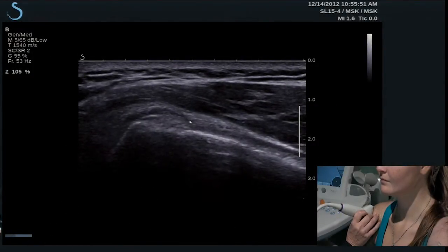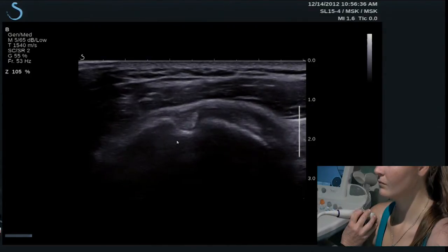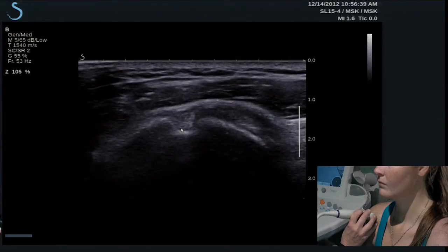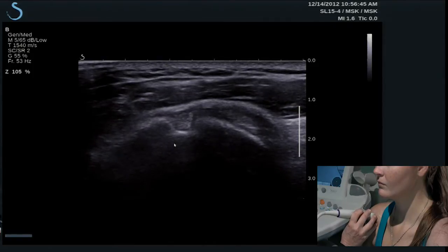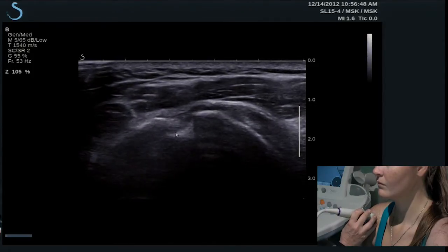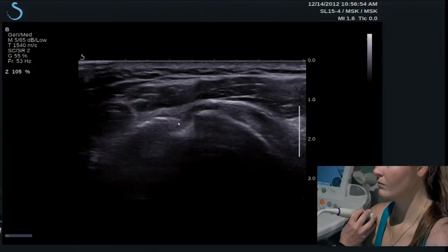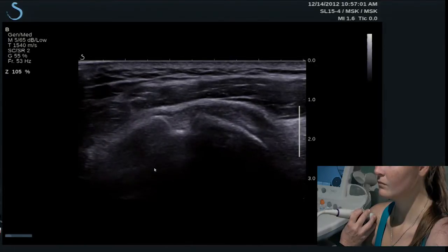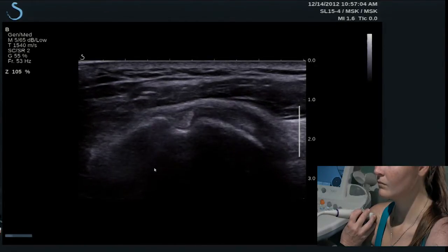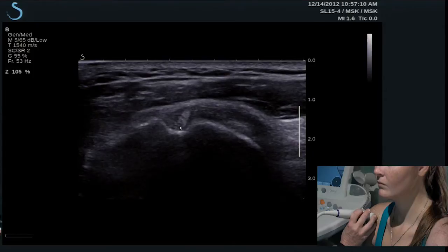And muscles. The normal tendon has a hyperechoic fibrillar pattern, as we see here in this bicep tendon. In the transverse scan plane, we see the bicep tendon in the bicipital groove as a hyperechoic oval structure. By making just a slight angulation of the transducer, we see that the tendon becomes more hypoechoic, or almost anechoic in echogenicity. This is the artifact anisotropy. By angling the transducer so that it's more perpendicular to the structure, it then takes back its normal characteristic — that's hyperechoic.